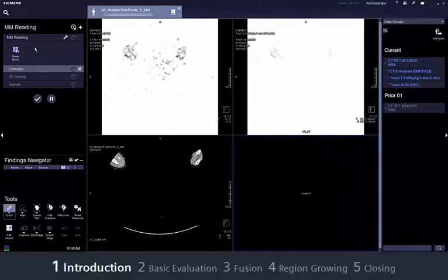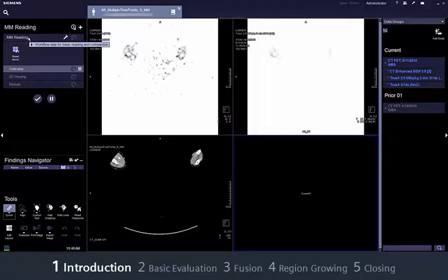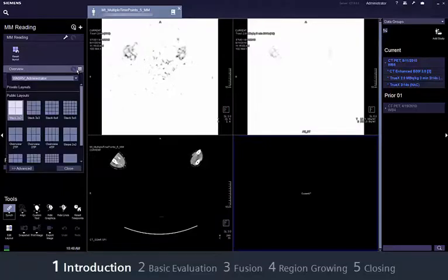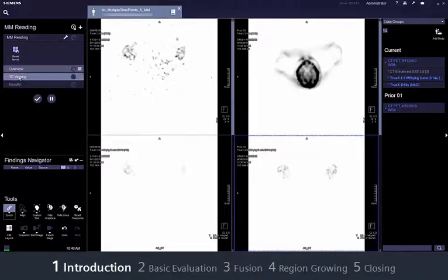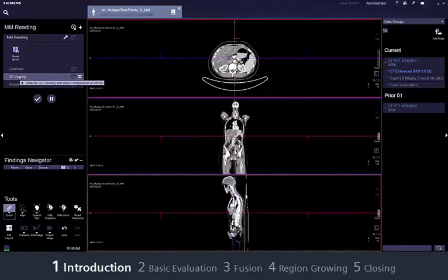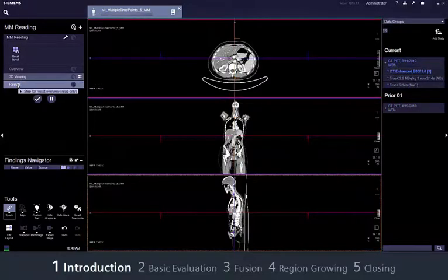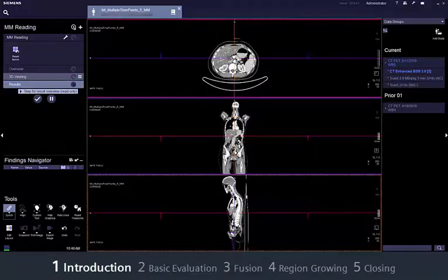The Syngo VIA MMReading workflow allows quick and efficient evaluation of routine cases. It is also used to compare images and series from virtually any modality and time point. MMReading basically consists of three workflow steps: Overview displays available data sets, 3D viewing provides the functions necessary for evaluations, and Results displays findings and snapshots as well as newly created ranges.